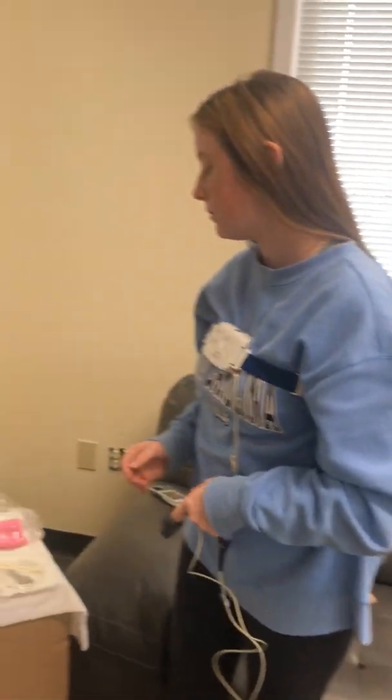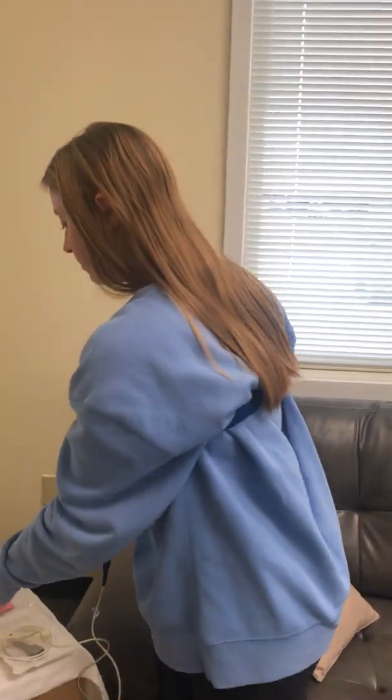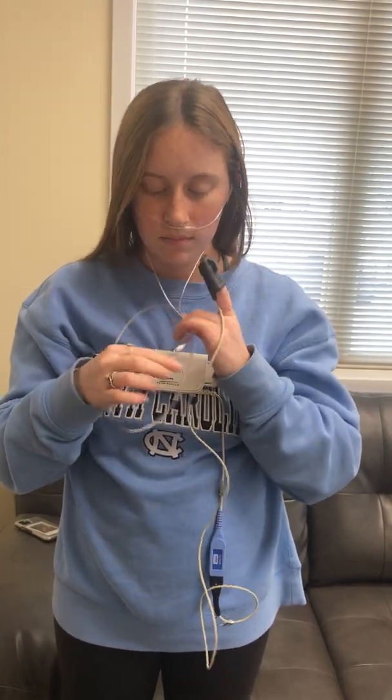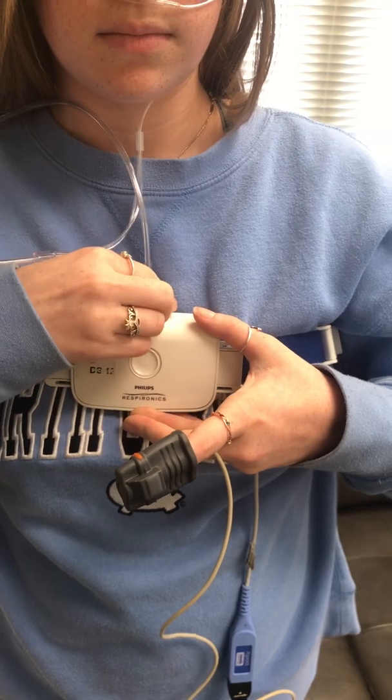The next item you need to grab is the nasal cannula. There will be two prongs — those items will go in your nose and the tube will wrap around both ears. There is an adapter to snug the cannula up as needed. You will then take the end of the cannula and simply twist into the silver tip until secured.